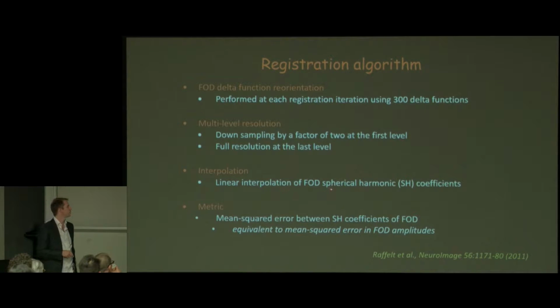Interpolation, we just do linear interpolation of the FOD spherical harmonic coefficients. It's a linear basis, so we can do that kind of interpolation. The final interpolation is cubic.